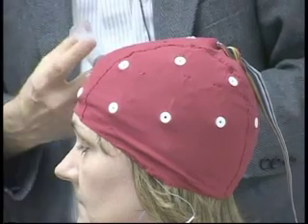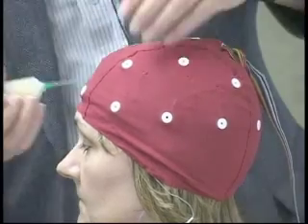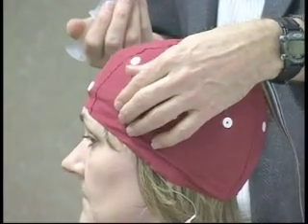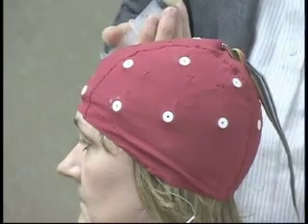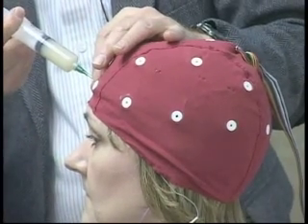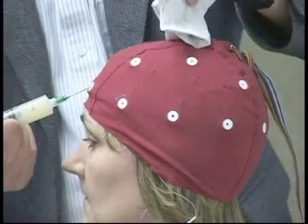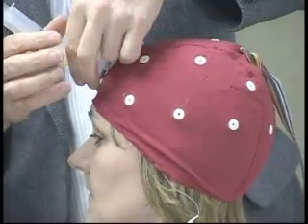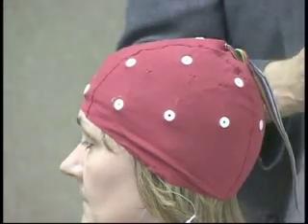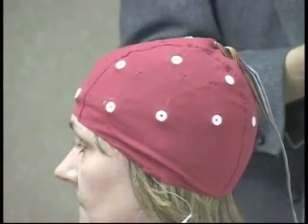Be a little more gentle at F8. And F7. You notice I'm holding down the sensor and I push on it when I'm done — that helps seat it in place and you get a better connection. I didn't really discover that until I started using brain mapping equipment that allowed me to see when I was getting a really good connection as I did it. And that's the value of having built-in impedance.